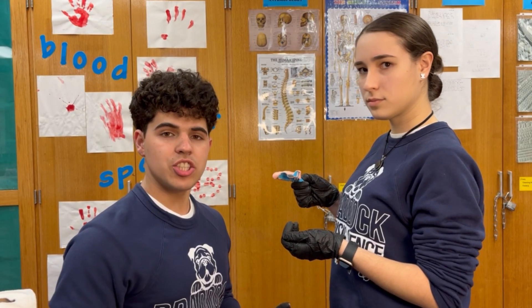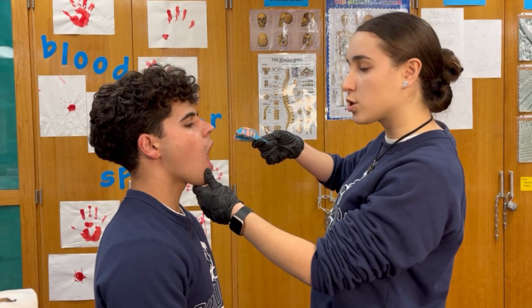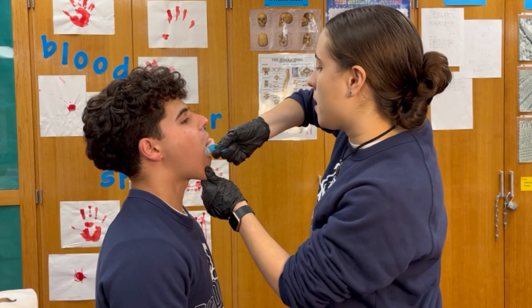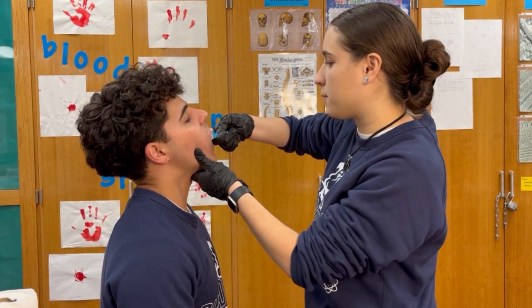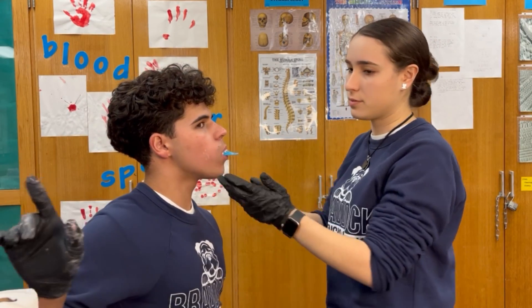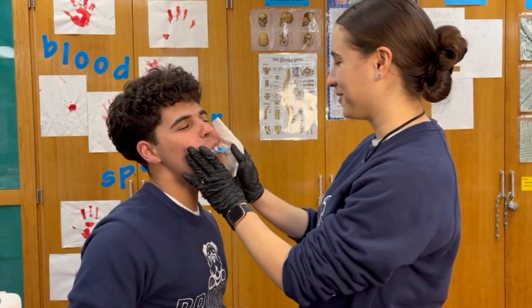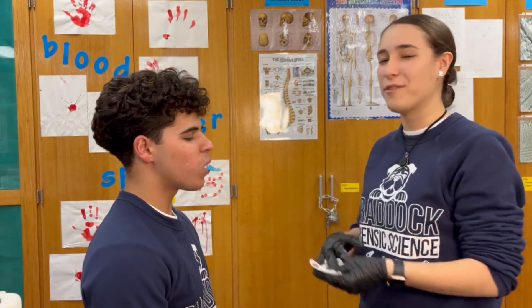She will insert the dental tray into my mouth. I will not aggressively bite into it because that could cause uneven results. The best way to introduce this into your patient's mouth is to come in through a diagonal, push down on the cheek, push in, and accommodate the upper lid to fit the impression. I now have 1 minute and 45 seconds of peace while the cavex dries.